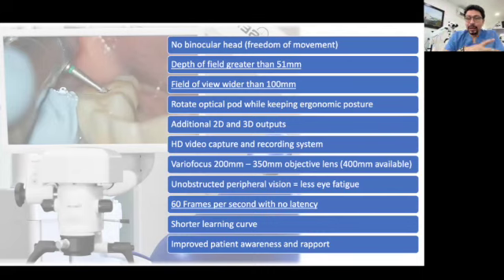For doing general procedures, we are going to work under the second, the third step most of the times, because working in that magnification will provide you a good field of view and a good depth of field, and you are going to be in focus all the time. If you are working under the highest magnifications, you will notice that you can have the tooth in focus, but maybe the burr in your handpiece is not going to be focused because the depth of field is going to be very small. So this is a good clinical tip.